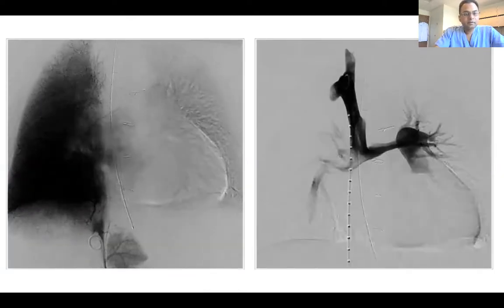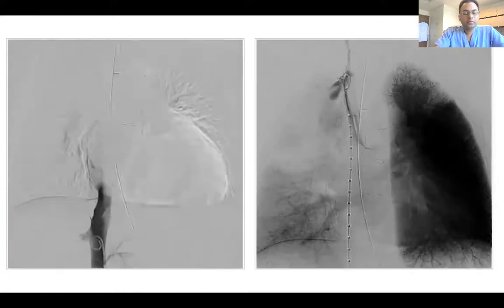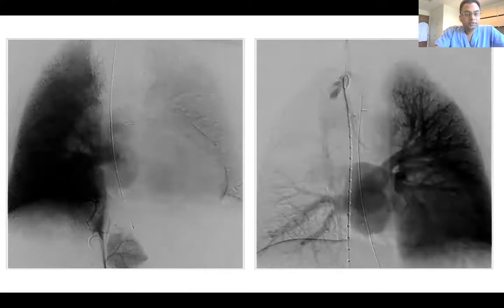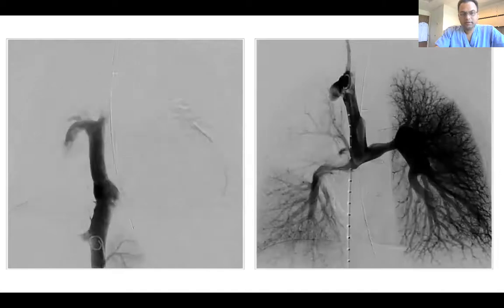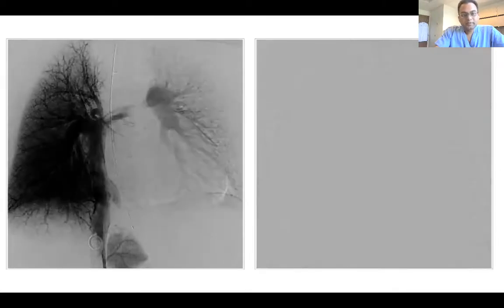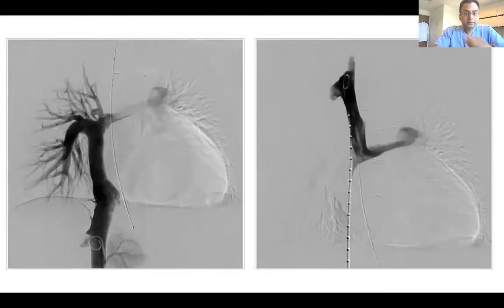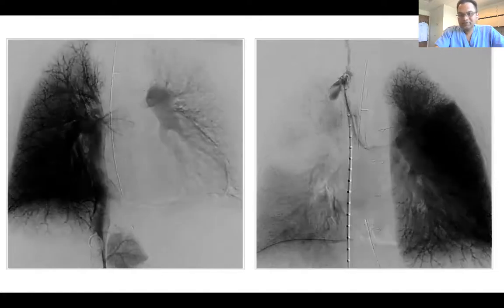This is a patient of mine who had hypoplastic left heart syndrome, so underwent a single ventricle palliation. You saw the ductal stent or BT shunt at the first stage, or the Norwood operation at the first stage, then superior cavopulmonary connection with the Glenn operation, and then the Fontan completion. This is an extracardiac Fontan conduit. As you can see, there is some streaming of flow from the superior caval vein to the left pulmonary artery here, and there is left pulmonary artery stenosis.